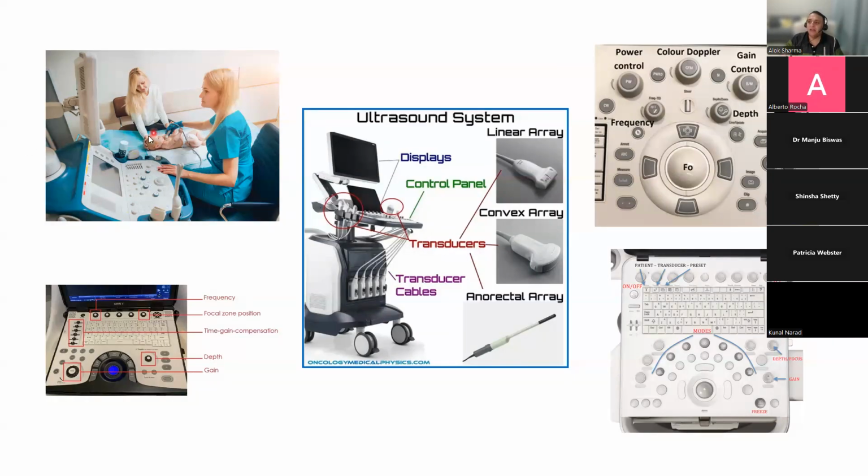And when you put that curvilinear probe on the baby's head on a very small fontanelle, it's looking at a very small area of the brain. But the depth in a preterm baby may have to actually be reduced a little bit, maybe 3 or 4 centimeters, with a little bit of magnification to actually get adequate resolution. And we'll talk a little bit more about that.